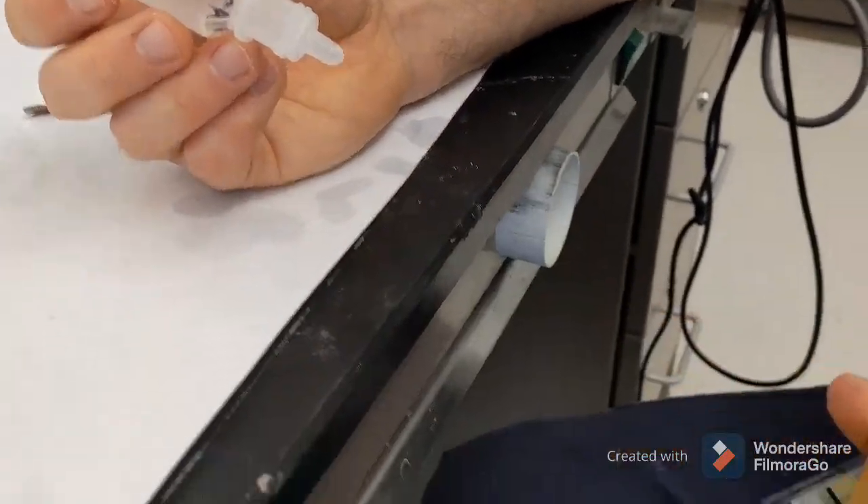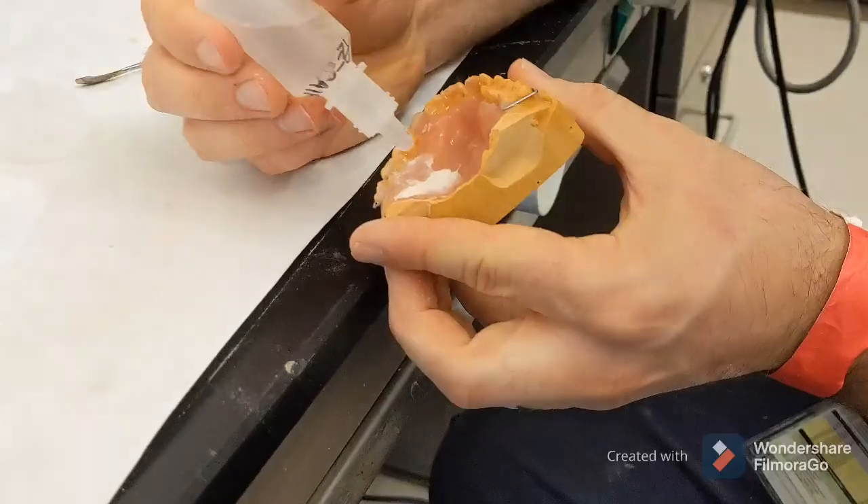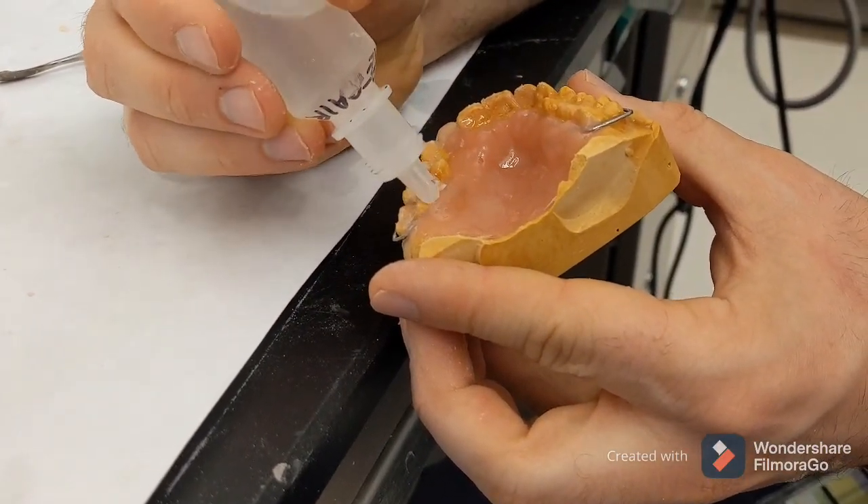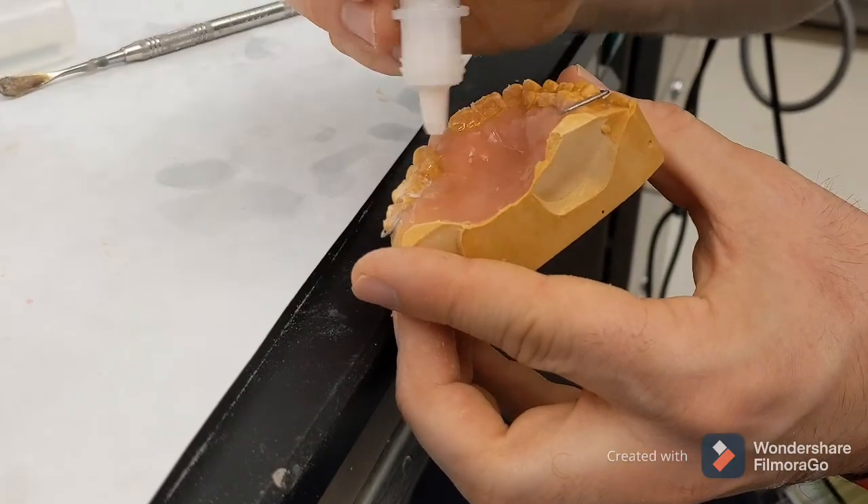So we about have what we need, about have the thickness we want — just need this area to be just a little bit thicker. Obviously if we get it nice and thick, it's just not going to break.